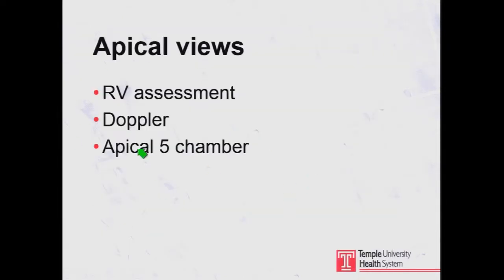The apical views are important for RV assessment. I think I've upset Dr. Cronzen because he likes M mode. And I will say that he is brilliant at M mode, as is Dr. Origema, and it's on the exam, so be careful.